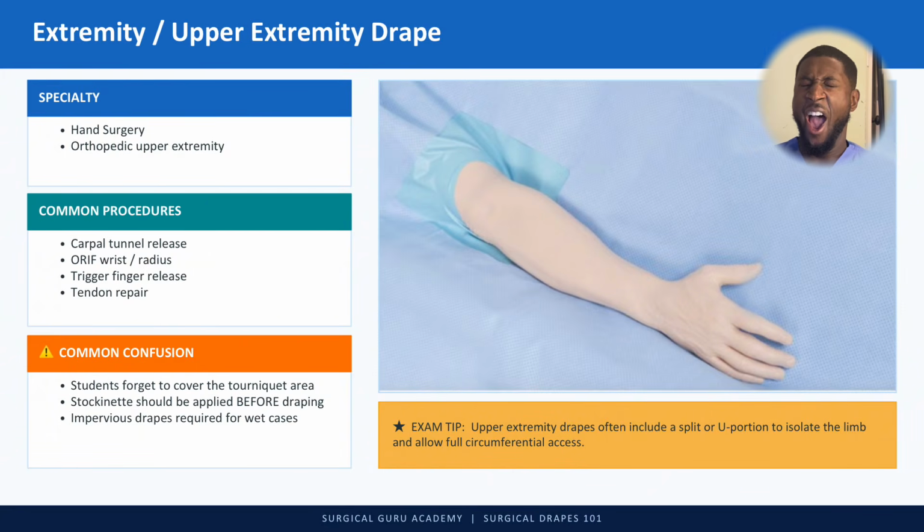Depending on the type of surgery that you're doing, and also surgeon preference, determines whether or not you're going to use a stockinette. Impervious drapes are required for wet cases. So yeah, most of the time we are using impervious drapes.